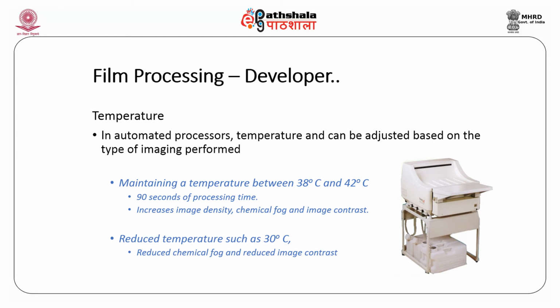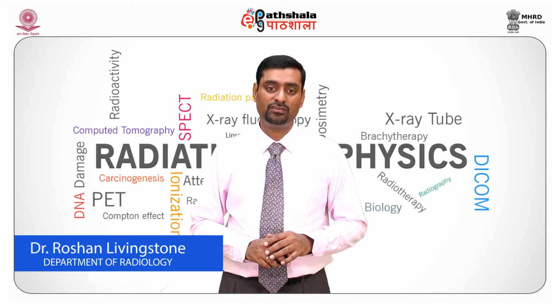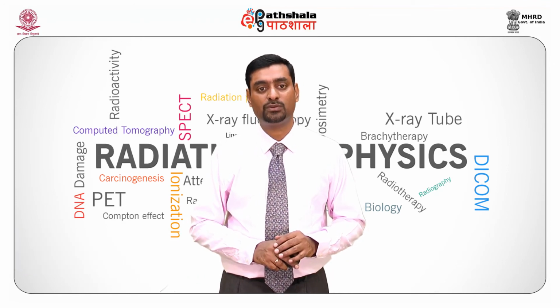But if I reduce the temperature and maintain it at 30 degrees centigrade, reduced chemical fog can happen. It reduces chemical fog and it also reduces image contrast. This is all possible in this automatic processor.